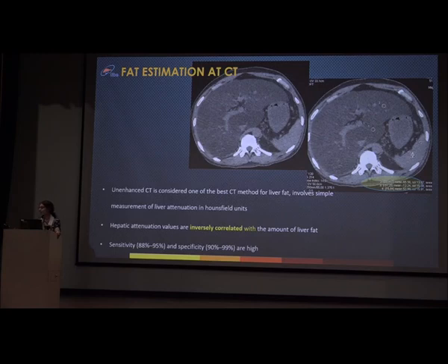Wilson's. Deposition disorder? No. Deposition disorder is going to cause an increase in the density of the liver, but your ALF patient, which has a lot of parenchymal edema, is my biggest differential for a steatotic liver. So I usually will not report it as steatotic attenuation. I will report it as reduced attenuation. Both edema as well as fat cause a reduction in the attenuation, and the clinical picture of the patient is as important as the estimation of HU. It's not purely objective, it's subjective, but has to be correlated with the clinical history.